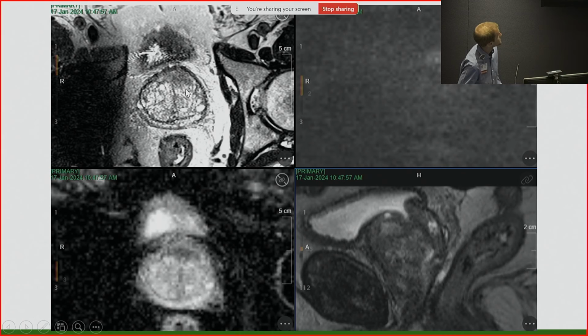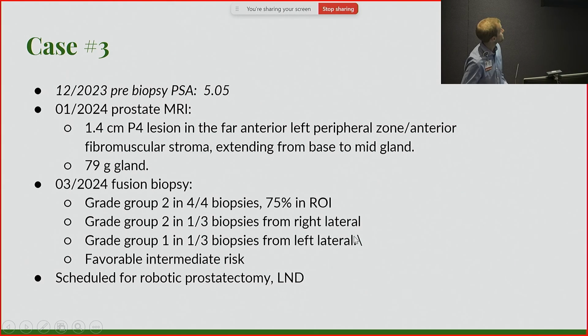This is the dark smudgy area that we're going to be concerned about. That's pretty far forward. That's way up there. See a little bit bright there, a little bit dark there. Here is a very telling picture of what happens when prostates get big. They start to bulge in. Where he's urinating from is the middle of the donut holes through here, and not a lot of real estate there. More of a slot canyon than the Grand Canyon, and it's starting to protrude with an intravesical component here up into the bladder.